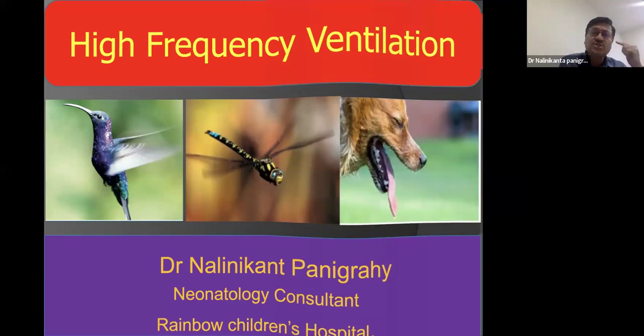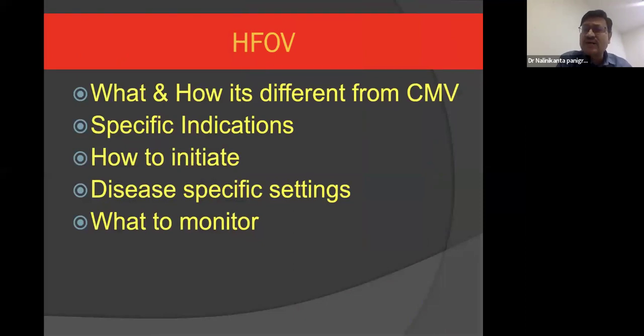Coming to HFO, in this presentation we will understand what HFO is, how it is different from conventional ventilation, and its specific indications, where it has an advantage over conventional ventilation. HFO is never a primary initial ventilation. In preterm babies, diaphragmatic hernia, pulmonary hypertension or air leak conditions, it is usually a rescue ventilation. If we decide to rescue the baby who is not improving on conventional ventilation, how do we initiate it, and how do we use it optimally in different diseases?